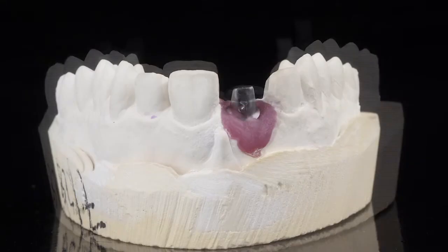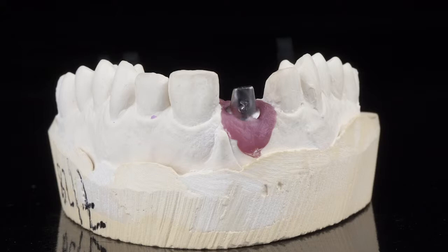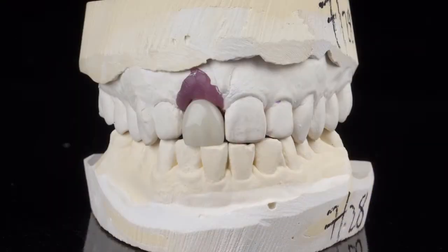The custom milled root contoured healing components would be essential in establishing an optimal emergence profile, aesthetic tissue contours, and interdental papilla for the final restoration.